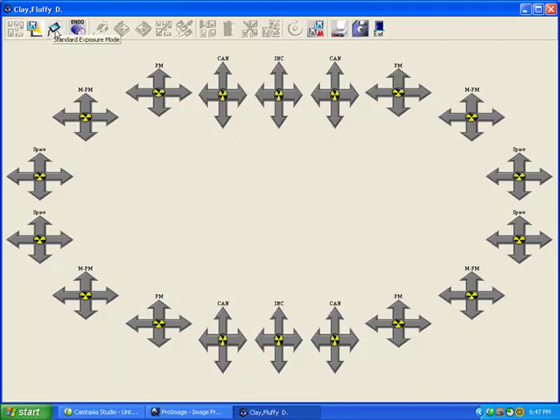Now we have two modes. We have the standard mode and the endo mode. The endo mode, as the name would imply, is for taking sequential shots on a single tooth, typically for root canal therapy. However, some people will use this mode to take more than one tooth. Essentially, you're going to usually want to stay with either a portrait orientation, such as in the canines and incisors, upper and lower, or with cheek teeth, which are all typically going to be a landscape orientation. And then when you finish with the teeth, even if you shoot different teeth in the sequence, you can drag and drop them to their correct locations.